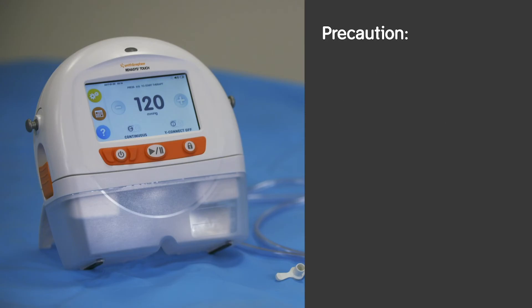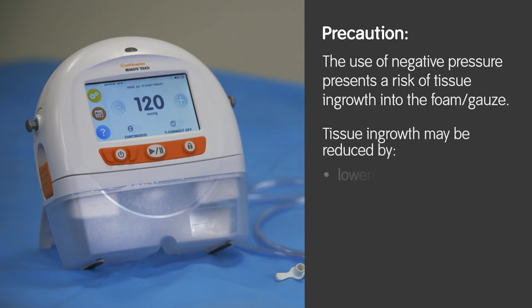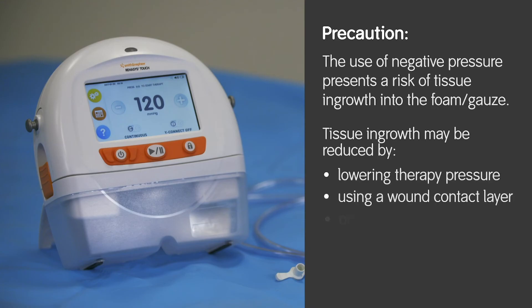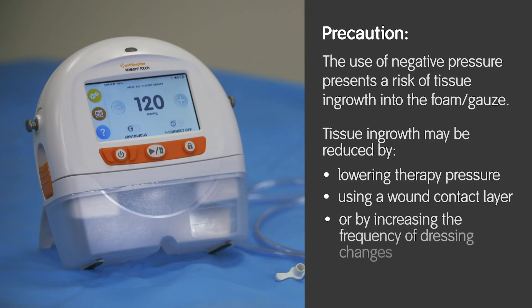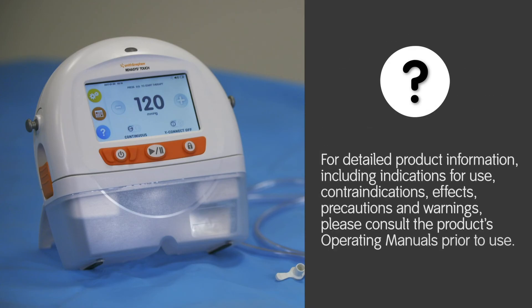Precaution: the use of negative pressure presents a risk of tissue ingrowth into the foam or gauze. Tissue ingrowth may be reduced by lowering therapy pressure, using a wound contact layer, or by increasing the frequency of dressing changes. For detailed product information including indications for use, contraindications, effects, precautions and warnings, please consult the product's operating manuals prior to use.